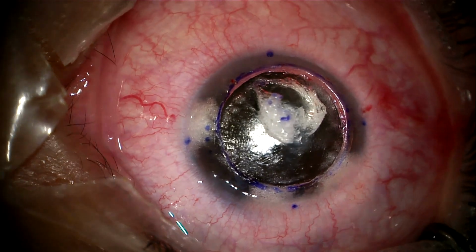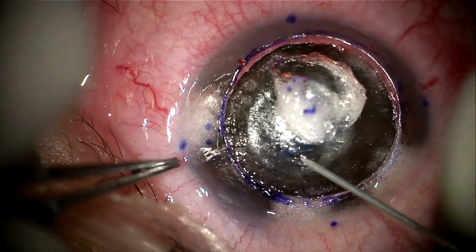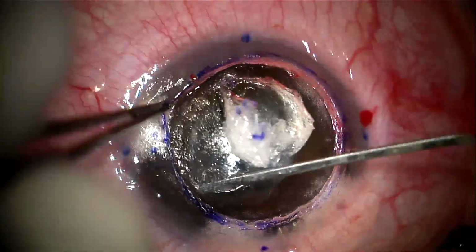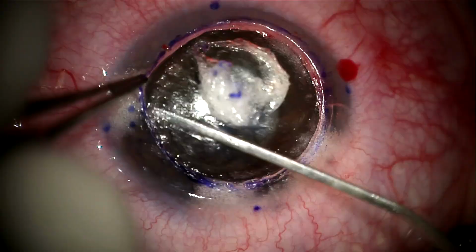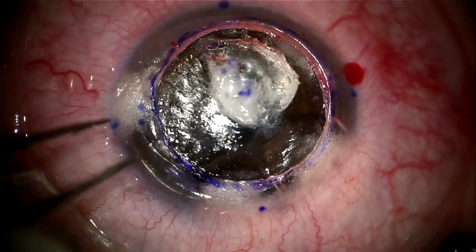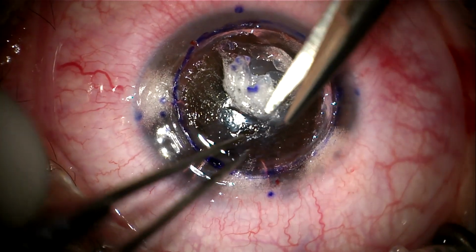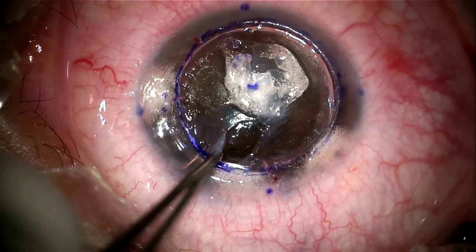the thinned central area. Now our aim is to reach as near as possible to the predescemetic layer. So we use the small microbubbles as a guide for dissection, opening one of the microbubbles using a bent insulin needle, followed by blunt dissection using a spatula. This is followed by cutting off the dissected stroma using scissors.